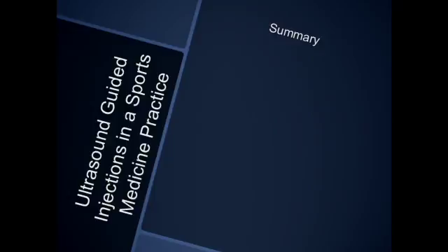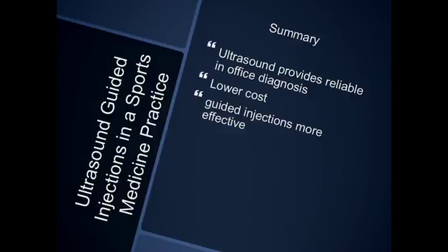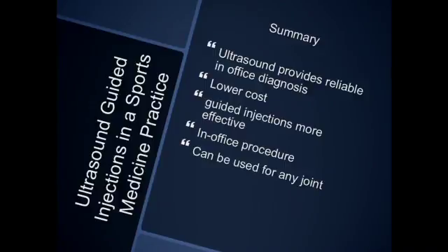So in summary, it provides a reliable in-office procedure for diagnosis as well as a procedural or therapeutic treatment option available for the consultant dealing with it. Low cost, more effective. Efficacy is something debatable, but it's more accurate and effective. And again, it's done as an in-office procedure and can be used for any joints that are superficial or easy to access.